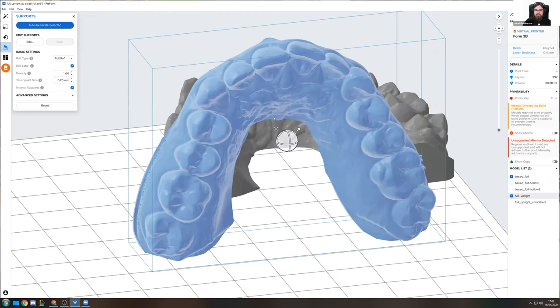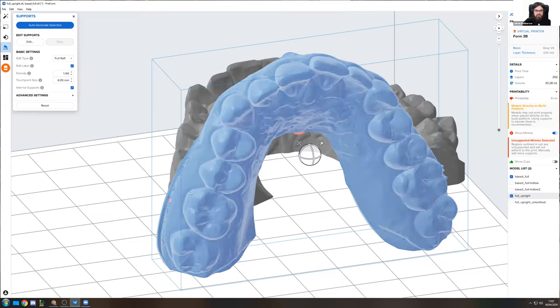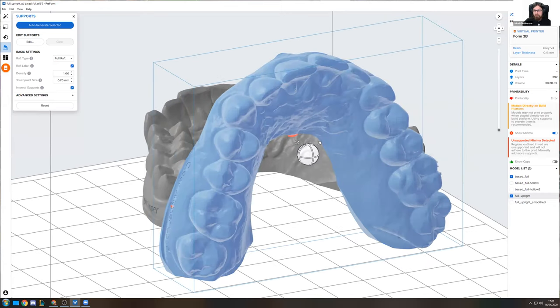But also a thing that can happen sometimes is that if you have an arch upright like this, you can have a couple of minimas coming out throughout the print. And here we actually have a couple of automatic functions as well to help you with this. You will see on the right side that the printability check in Preform will actually give you a thumbs down and tell you, hey, this is not printable right now. Please check what you're doing right there. And you can actually see that I have this little button over here, which tells me that I have 2 unsupported minimas. I can actually click this, and then I will see that I have one over here in the writing itself.